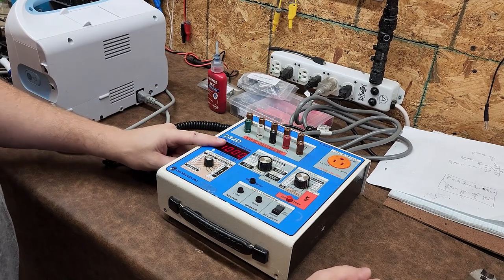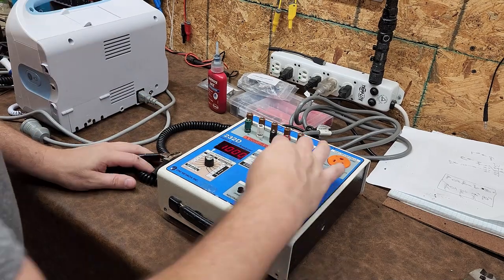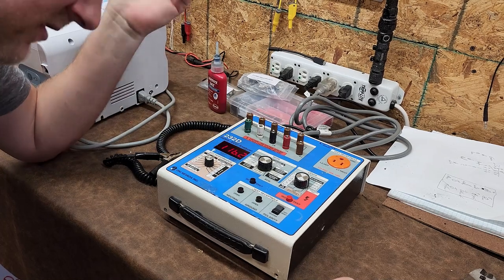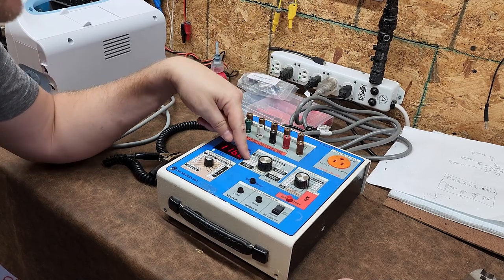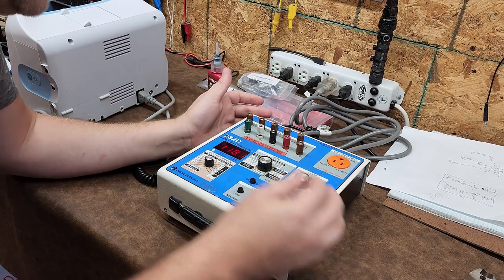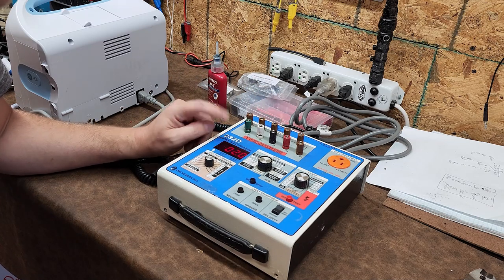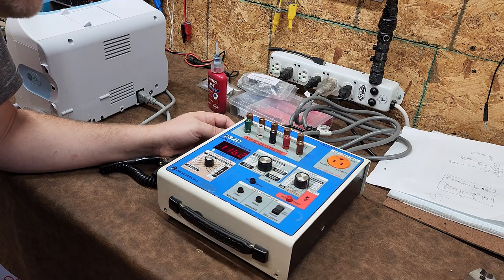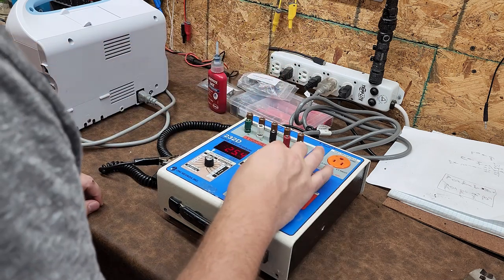I said earlier that L1 was hot — that's incorrect. L1 is considered neutral to ground, and L2 at the very top of the list is hot to ground. So up here, hot to ground — we should get 120 volts. We should have no more than 5 or 6 volts on L1 to ground, which is neutral to ground. And then L1 to L2, which is neutral to hot — of course that's what you're going to get.